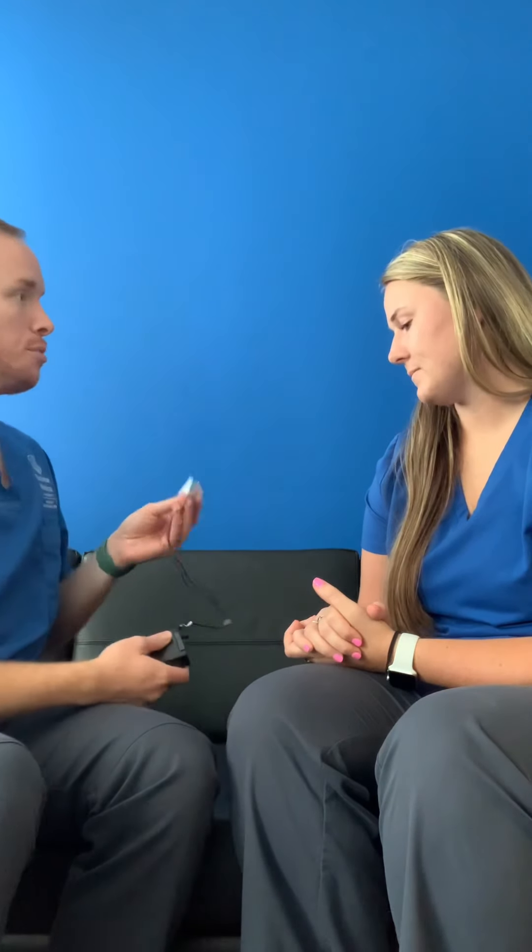So for today's intervention, we're going to be using a modality called neuromuscular electrical stimulation, which if you've seen a TENS unit, it's a lot like that. But this is the device — I just want you to kind of look at it. The on and off button is right here and we're going to be able to turn it up and down like this.